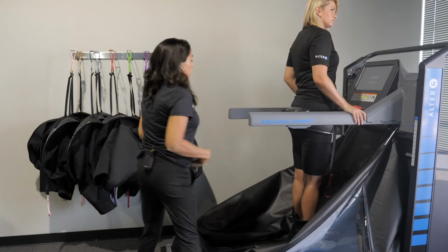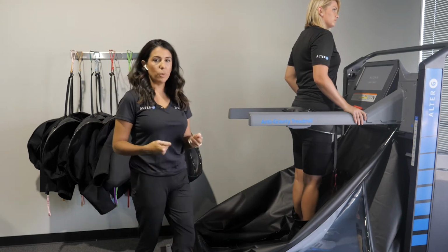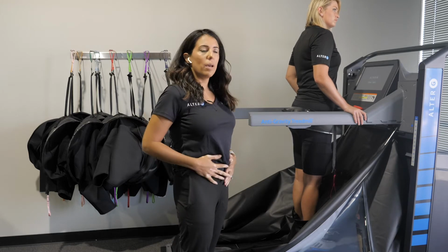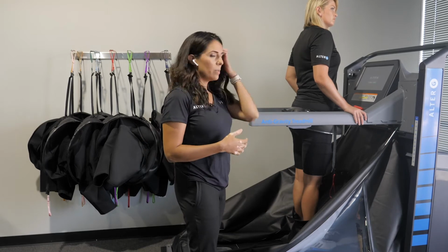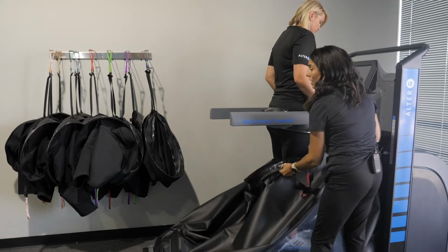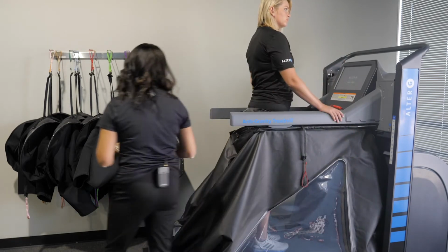The shorts, again, are snug but not overly tight, but if somebody needs extra support, you might want to pull them up a little bit higher, just so that they cover a little bit more of the trunk area and the hips, and give them a little bit more stability. We're going to go over the technology of how the treadmill works once it starts going, but I want to get her in first so you can see that.